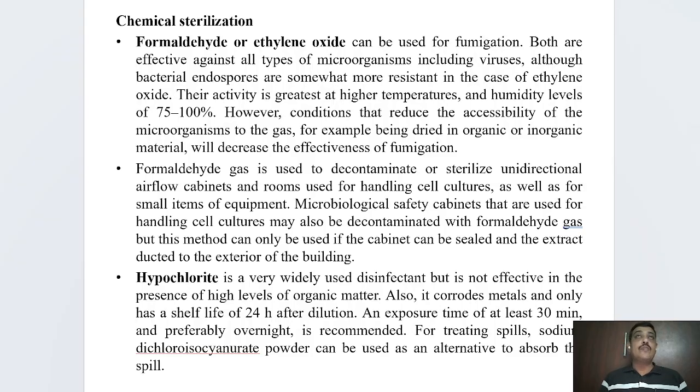During the previous classes we have discussed how to sterilize the consumables and the tissue culture wares that we are going to use for cell culture. But what about the tissue culture facility room? In the room's nooks and corners, there are microbes present in the environment, along with the gases present inside the cell culture room.